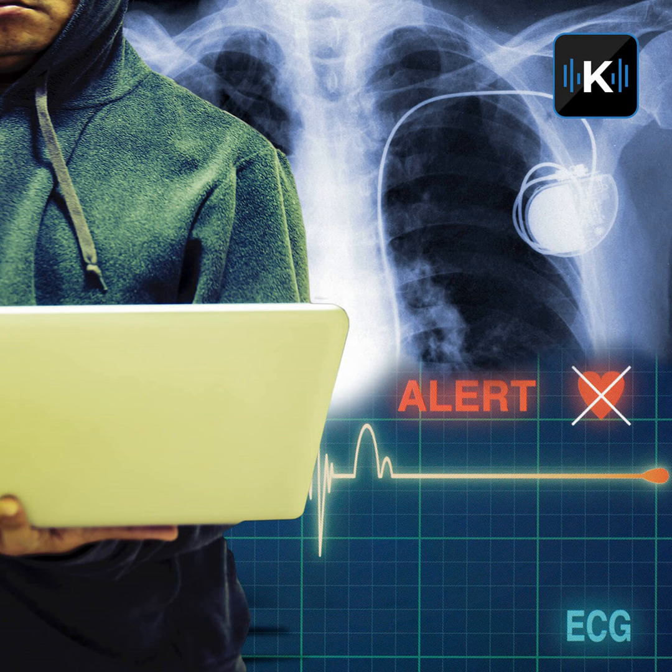What they don't realize is that I actually disable all of these warnings and that the RF functionality cannot be turned off. It's always listening. Even if you turn off the remote option on the pump, this attack will still work. RF transmitter is always listening. And once I took a look, I was actually quite shocked to find out how many vulnerabilities actually exist there.